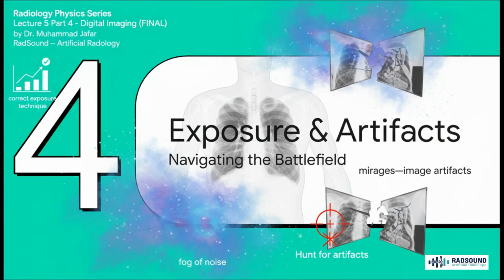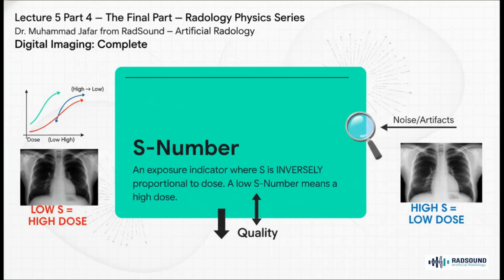Okay, so we've talked about the fog of noise. Now we have to turn our attention to the mirages, those pesky image artifacts. They can be just as dangerous and misleading. But before we can even hunt for an artifact, we have to ask a more basic question. Do we even get the exposure right in the first place? And that brings us to exposure indicators, specifically the S number.